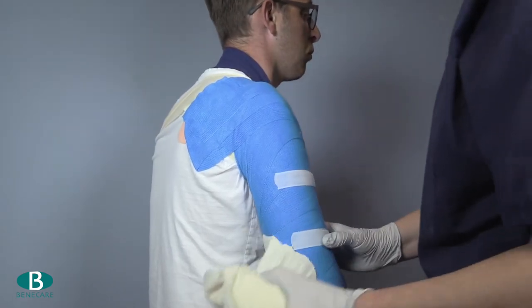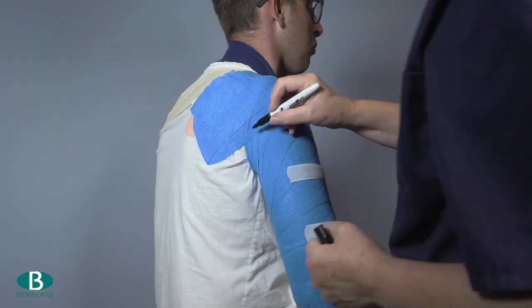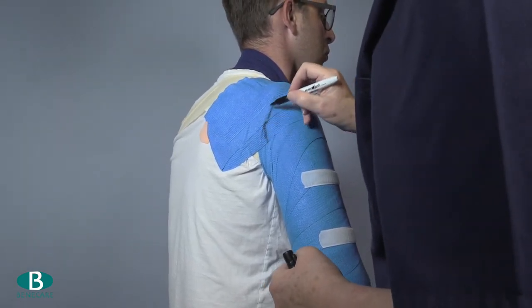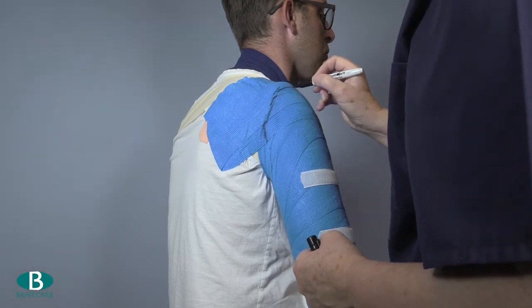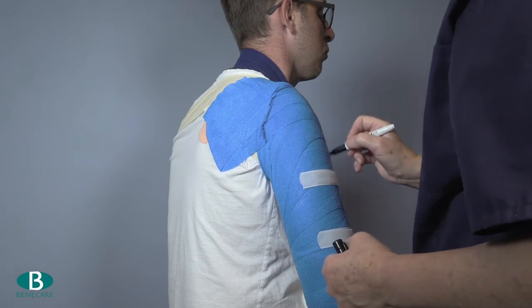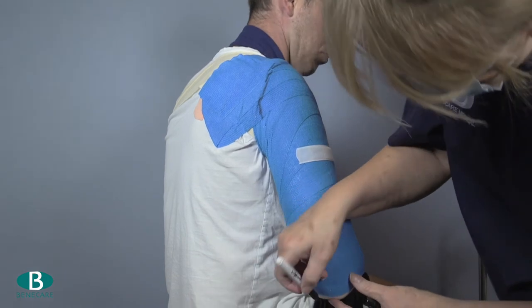Once the brace has reached the initial set — this can take approximately four minutes — remove the bandage and mark the brace at the proximal aspect so it can fit over the shoulder. This will provide no function with regards to the principles of bracing; however, in some instances it will help to hold the brace in place.